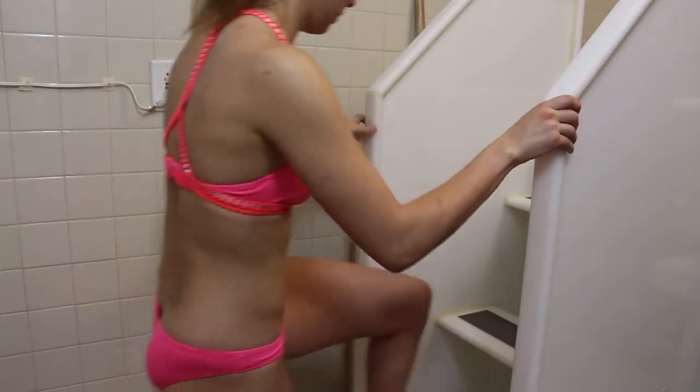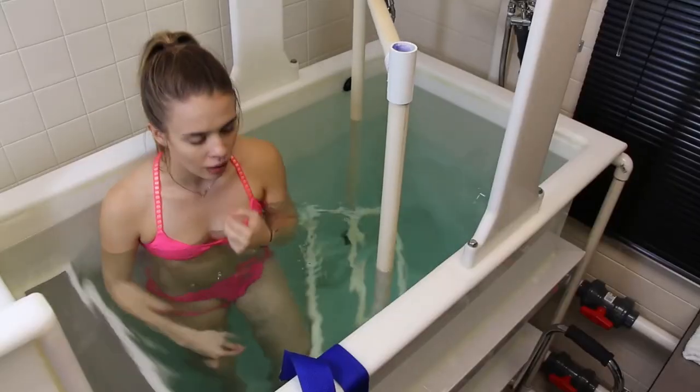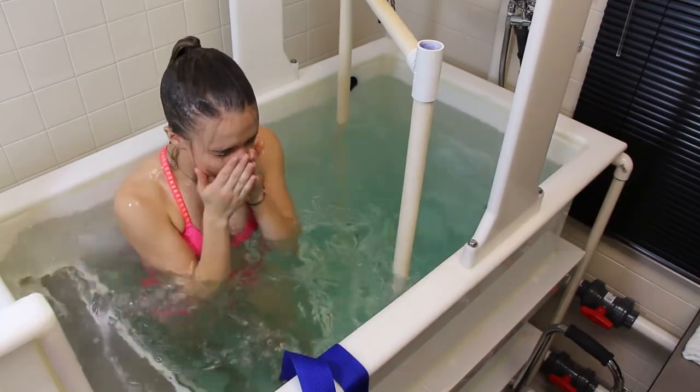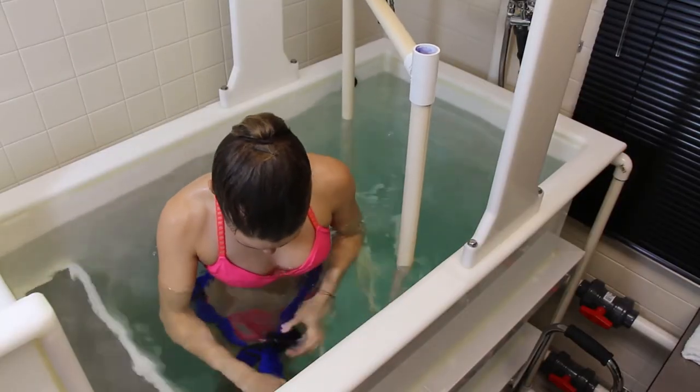Once you have the weight of the individual and an estimate of their residual volume and you know the temperature of the water, it's time for the participant to go into the tank. Have them walk up the ladder of the tank and then walk down the ladder on the inside as carefully as possible so they don't slip and fall. Once they're in the water, have them submerge themselves completely underwater — first to get completely wet, and second to make sure all air is out of their clothing so that doesn't add to their buoyancy. Any air trapped in their clothing or hair is going to add to their buoyancy and make them look like they have more body fat than they actually do. Have them get completely drenched, then strap the weight belt around their waist snugly enough that it won't fall off but not so snug that it's uncomfortable.